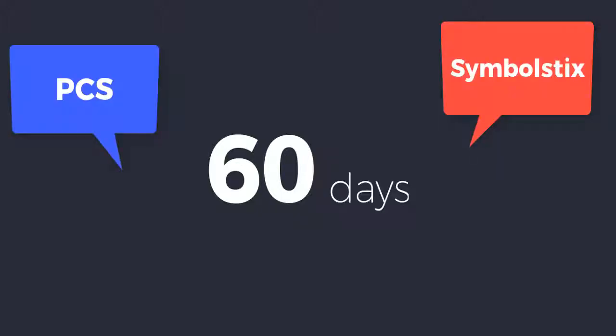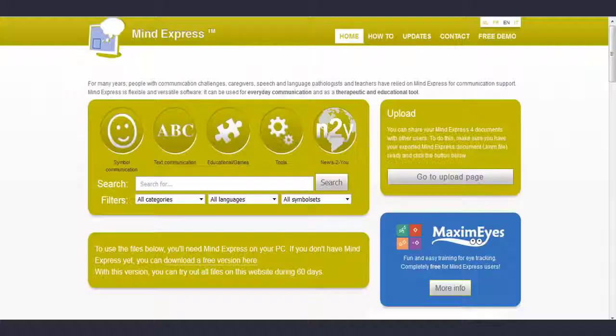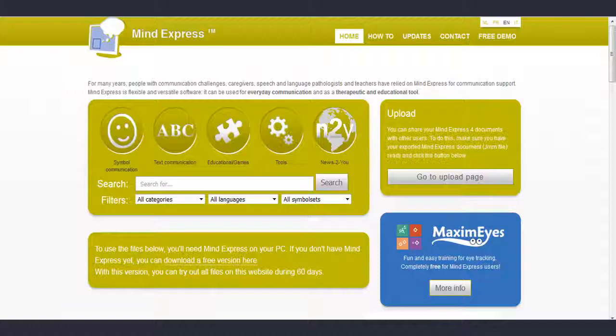You can try MindExpress for 60 days without limitations. The trial version includes symbol sticks and PCS symbols, real speak voices and different types of resources. In addition, once the demo is installed in your computer, you can download any file available from the MindExpress community website.